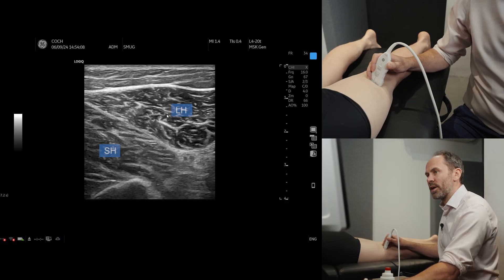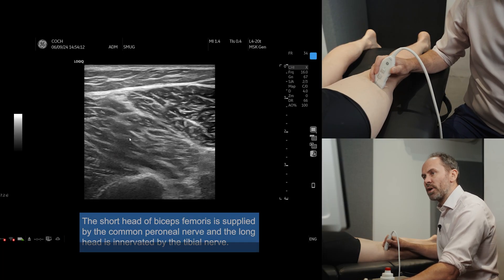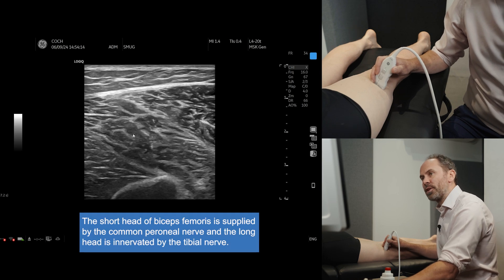Now next to it, more medially, is the long head. This is your long head supplied by the tibial nerve, and this is your short head supplied by the common peroneal nerve.